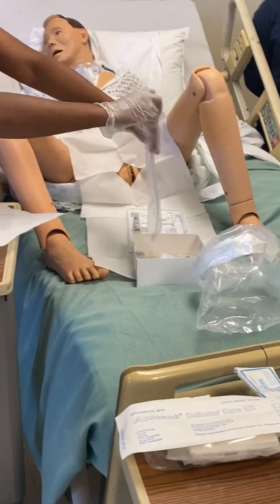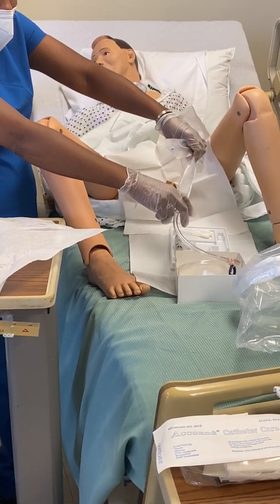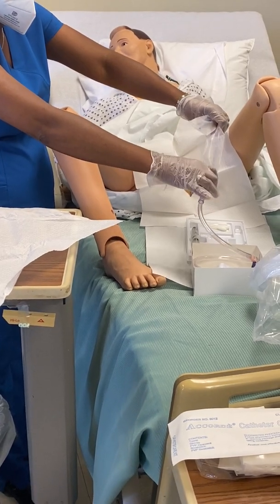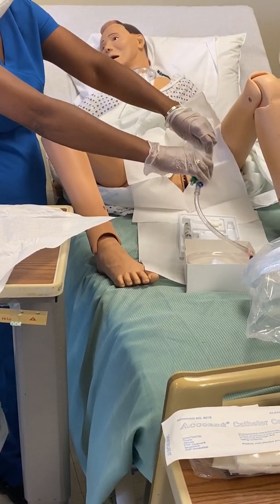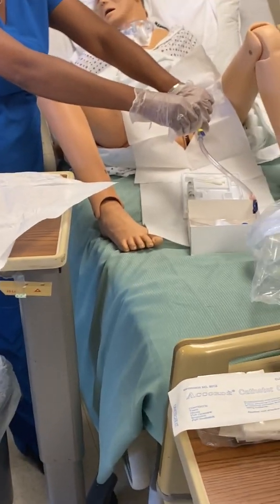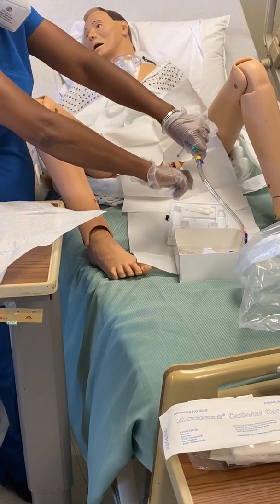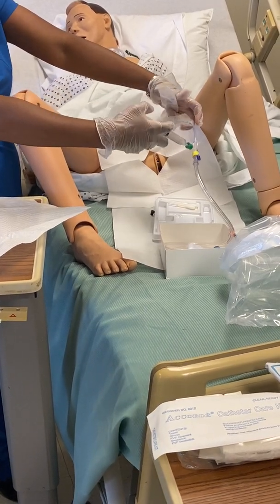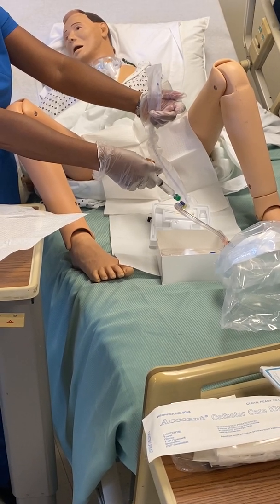There's been some confrontation with this, not really confrontation, but discussion with this in the past, where we've decided to do it, we've decided not to do it, to inflate the bulb. I'm old fashioned, so I want to see that bulb go up. Because if I get that catheter in and it doesn't fit or it doesn't stay, then I have to redo the whole process again. So that didn't do me any good to say I was doing a sterile procedure. Okay, so now I'm going to insert my saline into this balloon. And remember, everything's still sterile. Okay, and I'm going to see that balloon inflate, so I know my balloon is working.